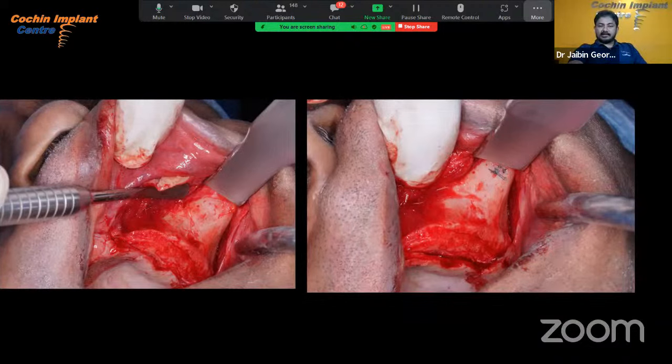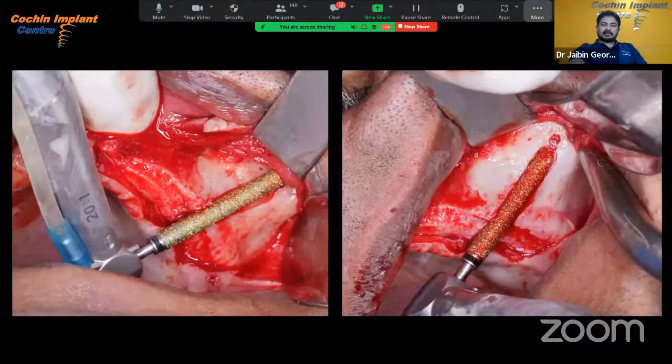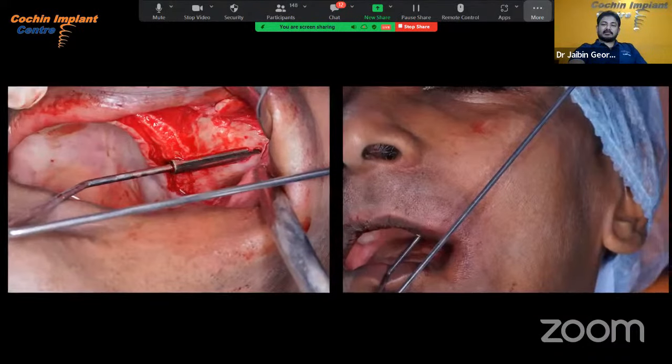We use the marking guide. You can see the marking here, the point of entry to the zygoma. We start with the diamond drill. We do the extramaxillary approach. This is an instrument called zygopath to make sure that we are away from the orbit.